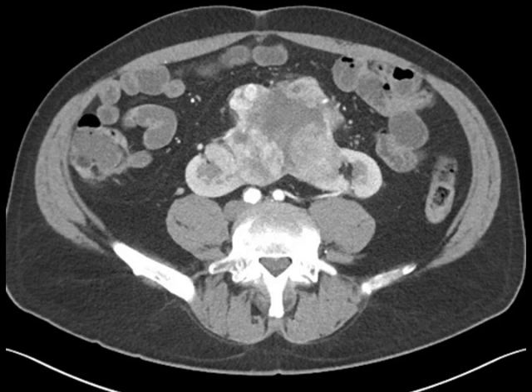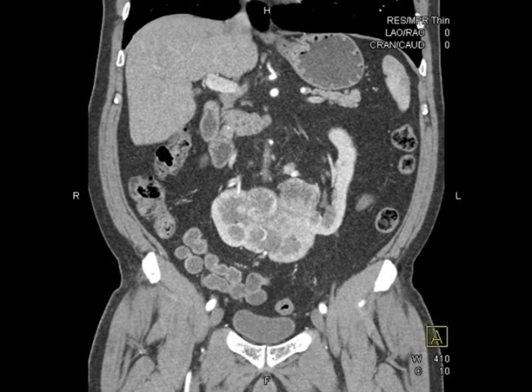Here's a nice example of an entity that we just don't see that often. If you look at the CT images, you realize that the kidneys are not in the correct location. You don't see kidneys in the renal fossa bilaterally; rather, they're both located abnormally medial and inferior, and they appear fused at the midline.